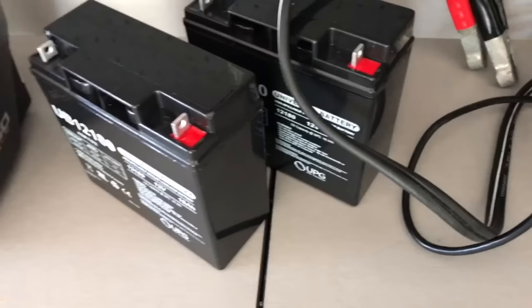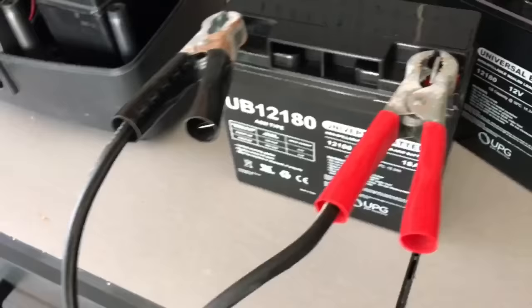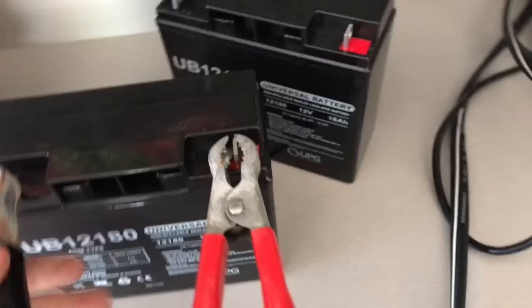Go on Amazon and search for the UB12180 battery and you'll find new ones that sell for about $32 a piece, so $64 will get you two batteries. These just came in the mail right here. I have a typical battery charger — go ahead and connect onto here. Battery percentage is 100%, so I tested both of these already and they're ready to go.